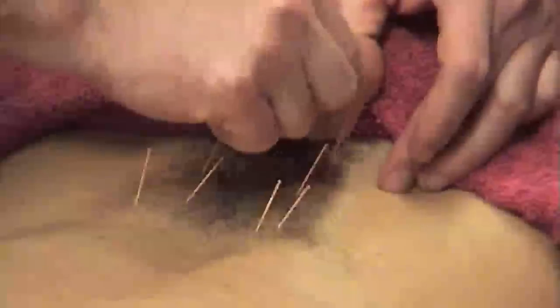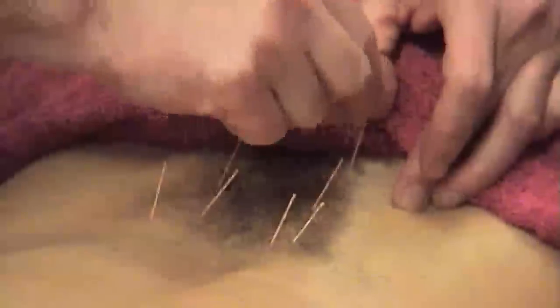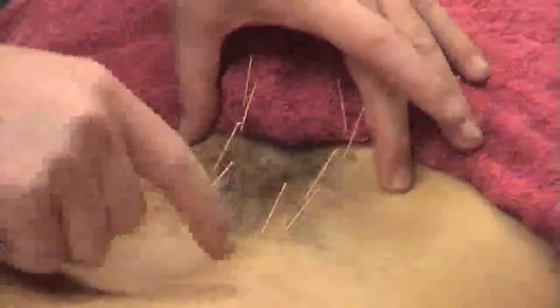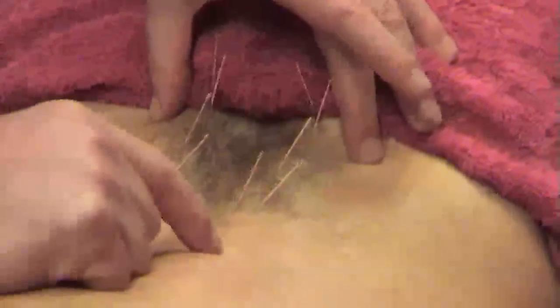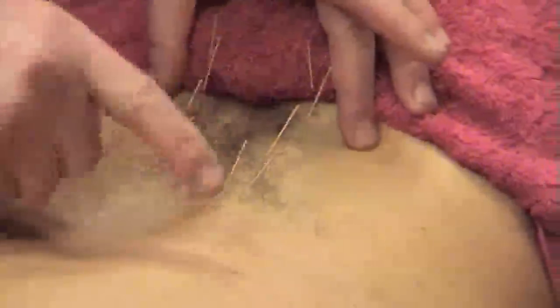Alright, so just start — medial to the PSIS. But you can start just down medial to the PSIS. It's quite dense tissue down through there. This is not how I normally do it — this is just the first process. Okay, and then just do five or so, pretty much one out from each lumbar vertebrae.